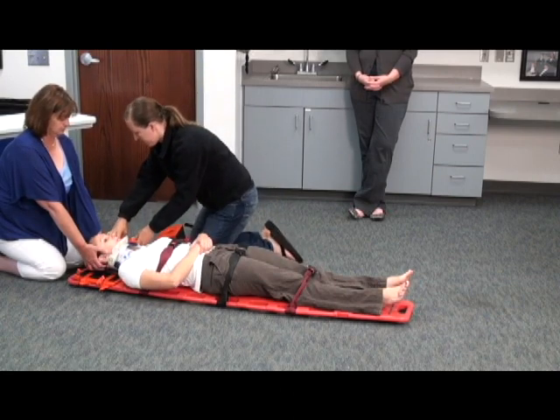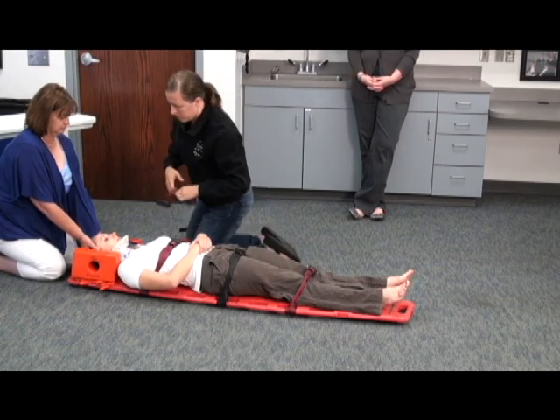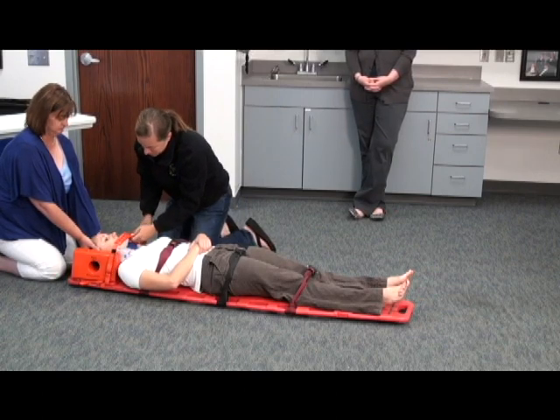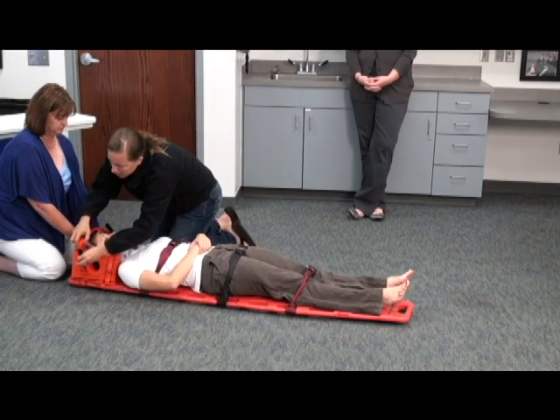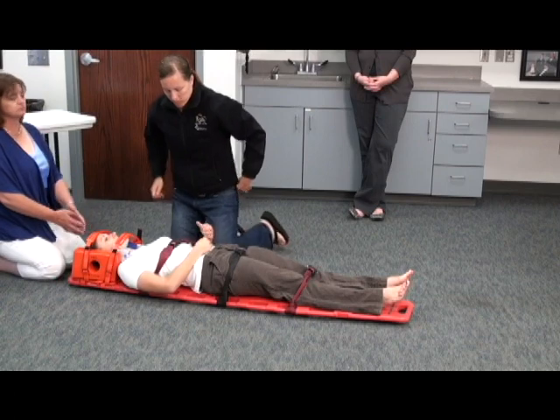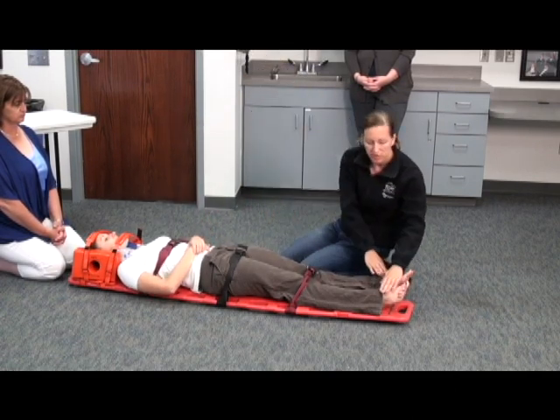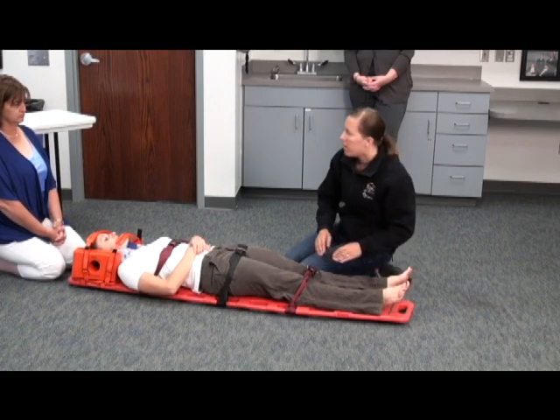And I'm going to secure her head. And finally, you can let go of the C-spine. I'm going to do one more CMS check. Does she have good pulses? Pulses are good. Can you feel me touching your hands? Yes. Can you squeeze? Which hand am I touching? Right. Now? Right. And pedal pulses? Pulses are good. Can you feel me touching? Yes. Which one? Right. How about now? Left. Can you push up? And I'm done with the station.